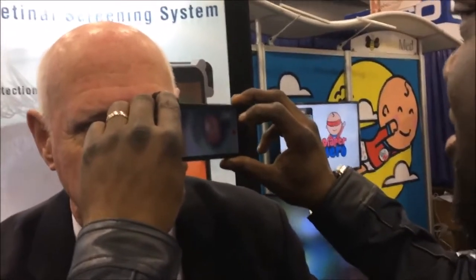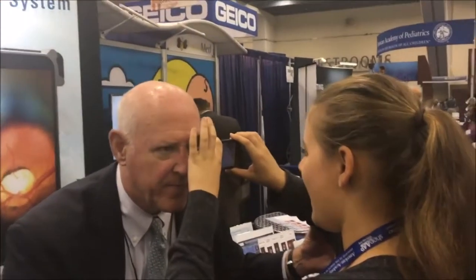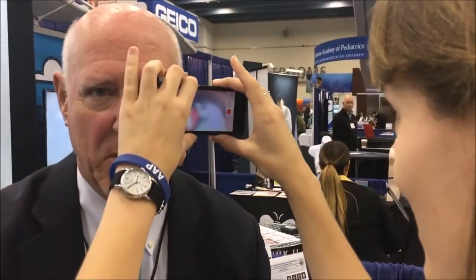Now you can tilt the phone to get more structure, follow the vessels. This is really digital. Oh my goodness. Got it. That was pretty quick.